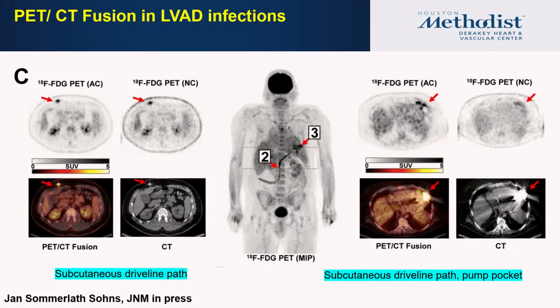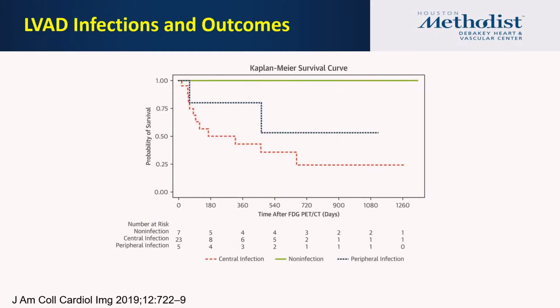So it's very important to assess all 4 components of these patients with LVADs, to make sure that there is no uptake. And you can see the outcome of these patients is very bad if we detect infection. If there is no infection, they did well in this series, but if there is peripheral infection, they did intermediate, but with central infection, especially if the device itself is infected, these patients are going to do worse, and there is very high mortality associated with that.